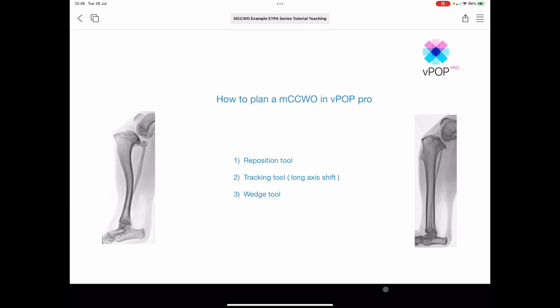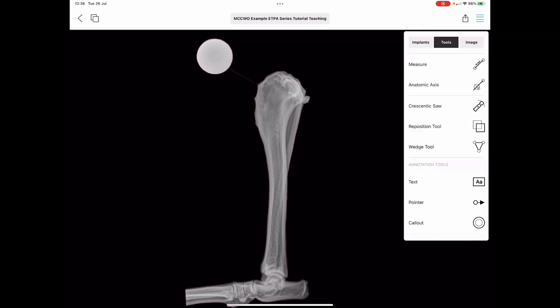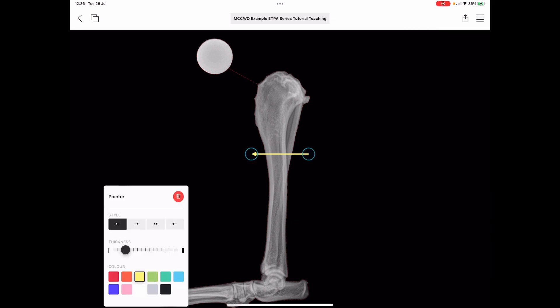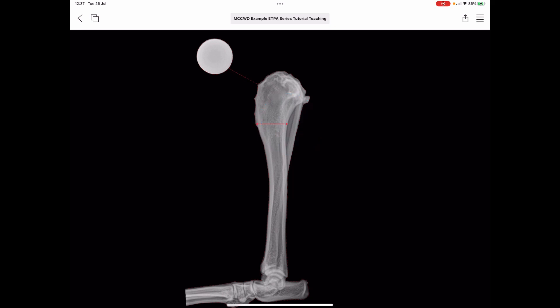Let's go right from the start using the reposition tool. We'll be using the tracking tool to accommodate the long axis shift and the wedge tool. First, go to your tibia, and I recommend you take the annotations tool and define with an arrow what the distal component of your wedge is going to be. Generally, I would recommend you start at the distal extremity of that typical tibial crest right there.